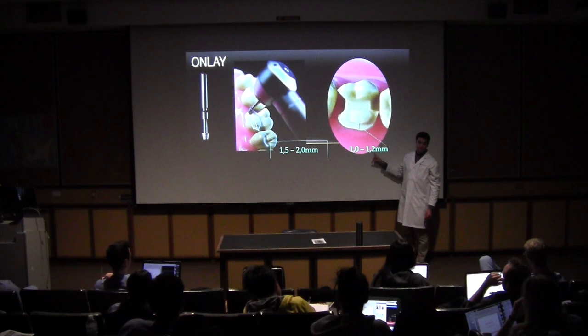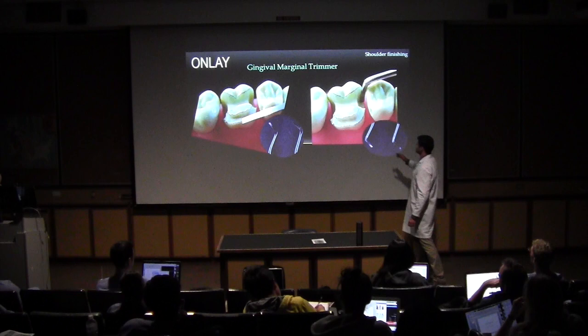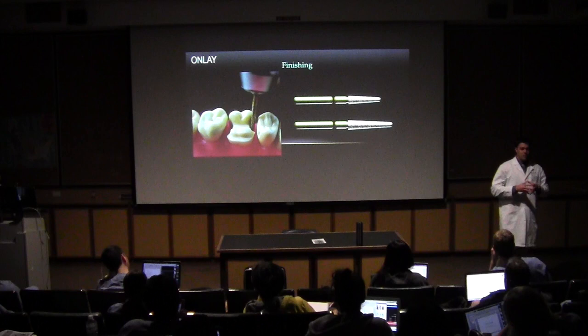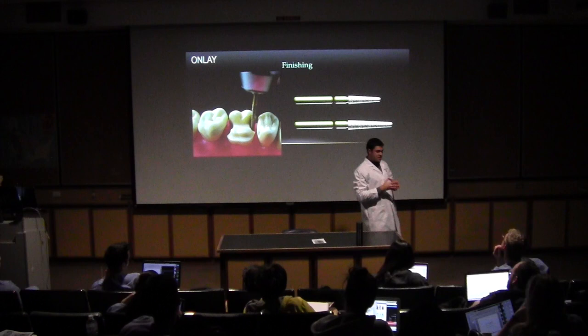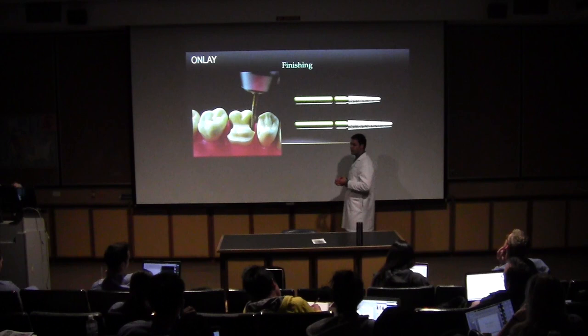And in the same way, we are going to use the gingival marginal trimmer on the margins to remove unsupported enamel. We use it on the proximal boxes, and we are going to use it along the shoulder too. Okay? Again, finish the prep always with an extra fine or fine diamond point. And remember to round all angles along your preps to avoid stress concentration. I keep repeating this, but this is very important for ceramic restorations. If you don't do that, your restoration will fail.